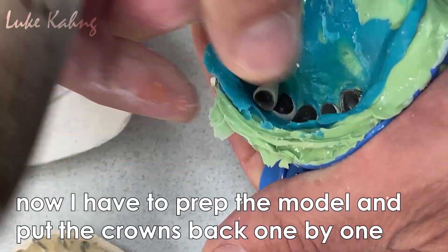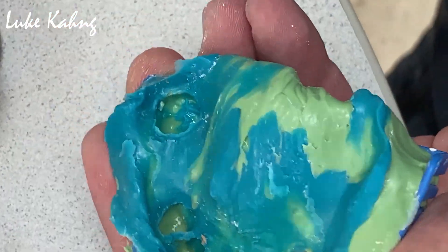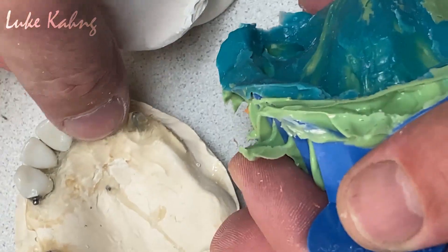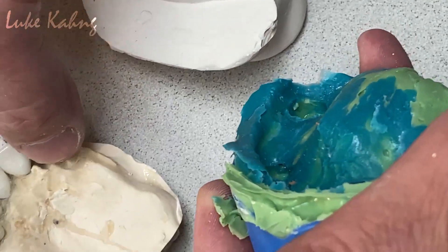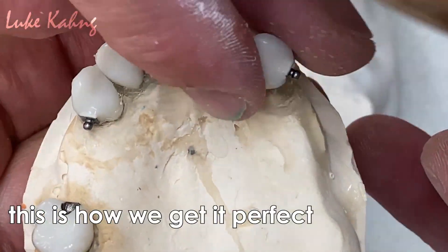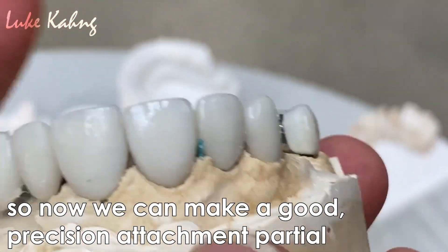Alright, now I have to prep the model. So we put it back one by one, just like we did before. See — that's why we got the perfect result. The reason I like it is this is all alignment together. So now we can make the good precision attachment partial.